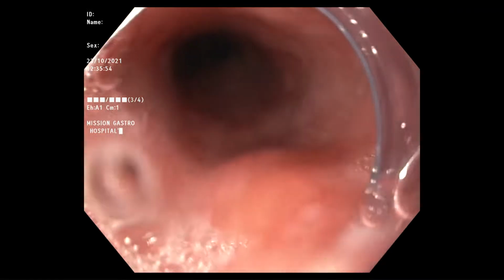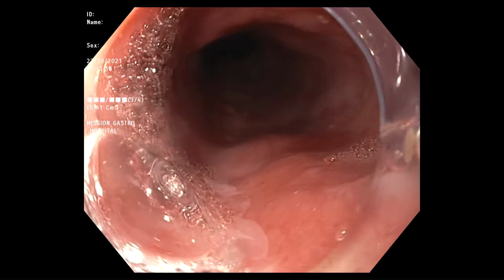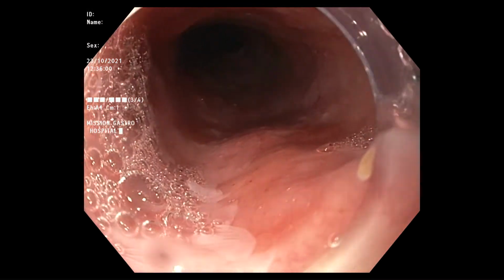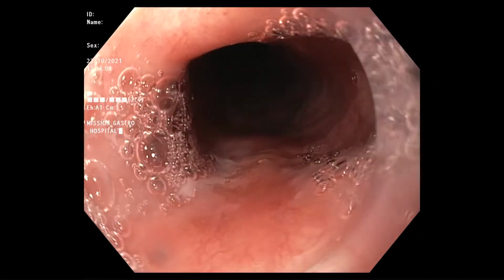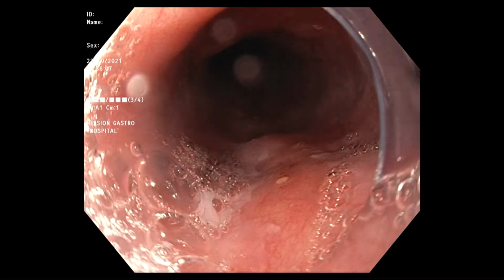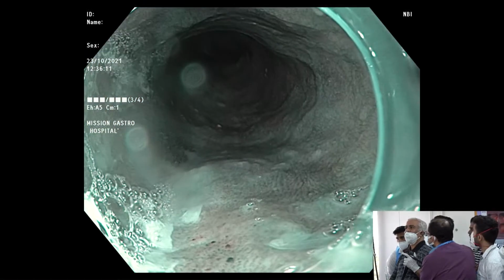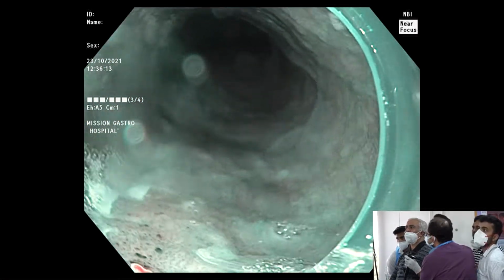See this? See this kind of like a membrane? Can you see that? Sloughed out. Yeah, I think that is what is giving, because see what it looks like, the IPCLs are not sinister looking at all. Maybe more inflammatory than anything else.